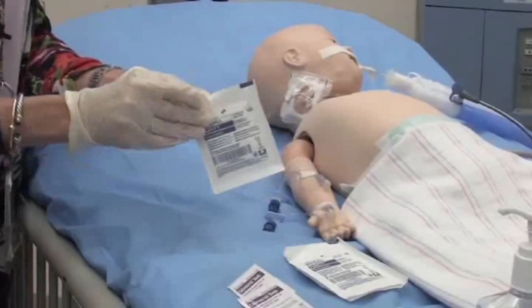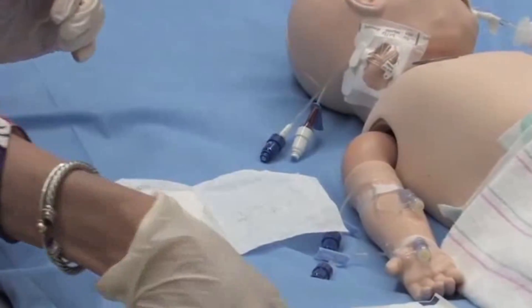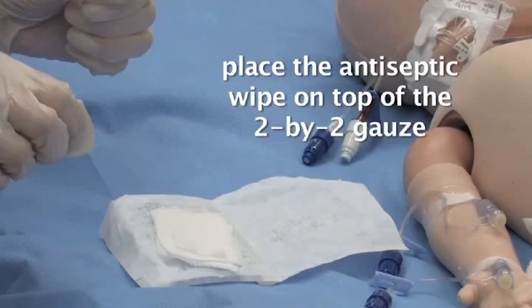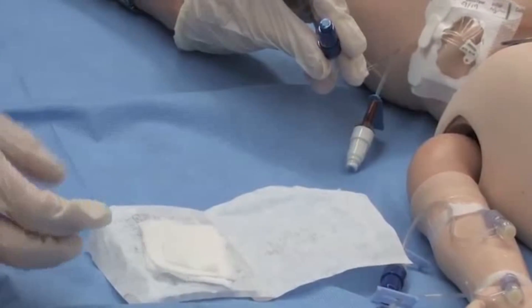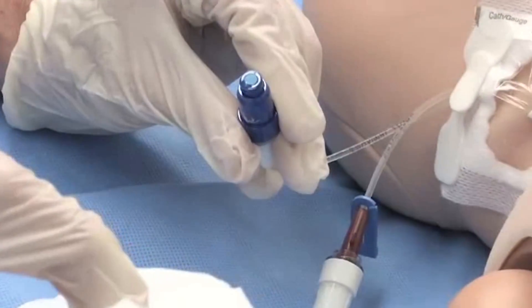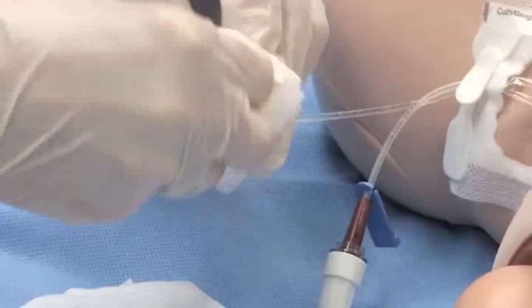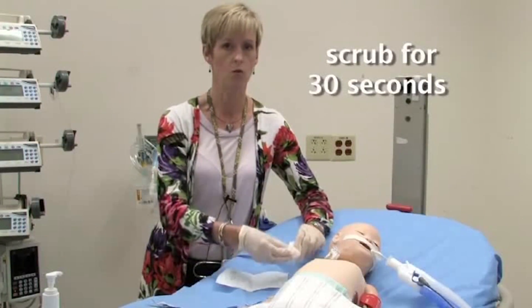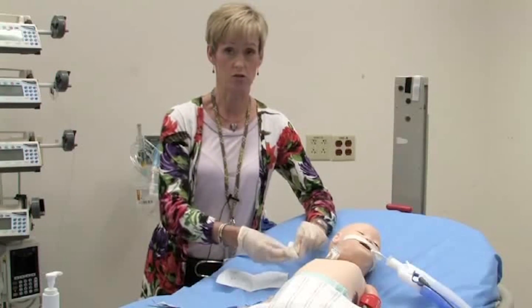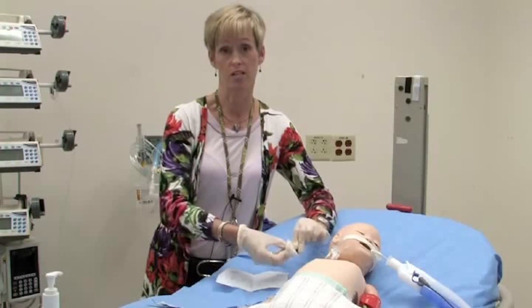Next, I will open my 2x2 gauze sponge. A chloroprep or antiseptic wipe that your institution uses is placed on top of the 2x2 gauze. I pick up the appropriate tube ending, take my antiseptic swab and 2x2 gauze, wrap it firmly around the end and scrub. Here in the MS ICU at Children's Hospital Boston, we scrub for 30 seconds, as we have found this reduces our chance of central line infections. Other institutions may use less time — for instance, 10 or 15 seconds. Please go by your own institution's policy.